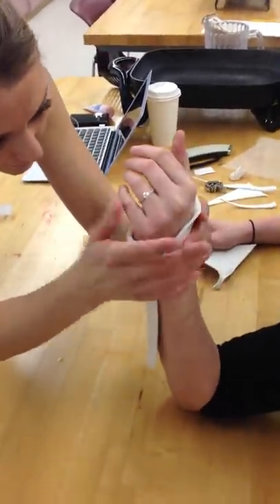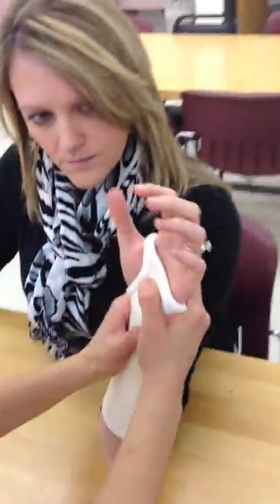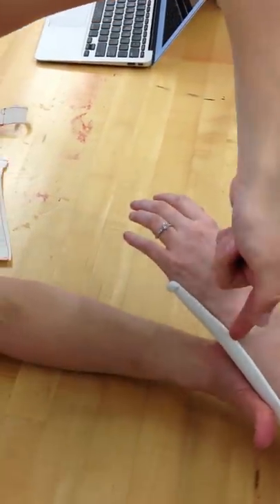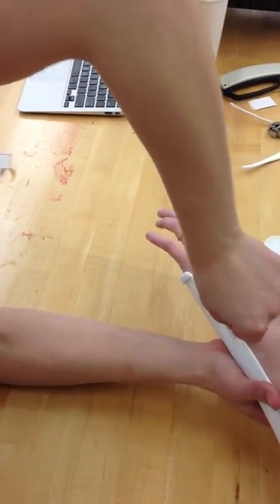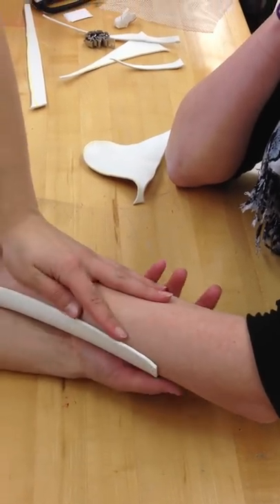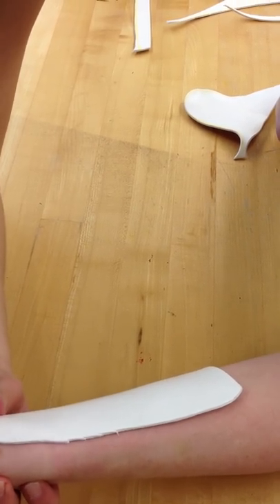Before one last check — make sure the DPC is clear and she can bring her thumb around. The length is good. I'll bubble it out — make a little bubble there for the ulnar styloid. I'll make a little X. The rest of it looks pretty good; it might be a little more than half, but that's okay. Better than too short. I'll round this out and smooth that side.